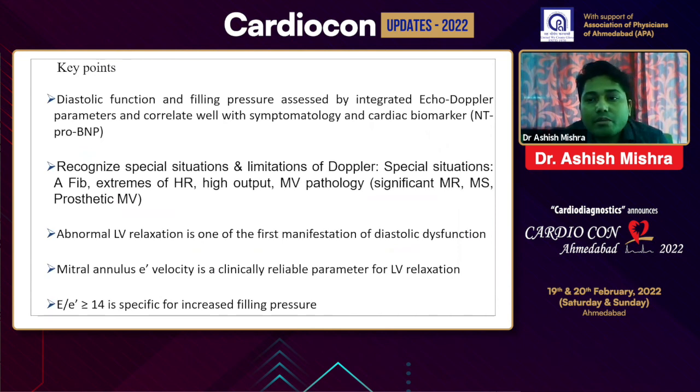Coming to the end of our talk, the key points: diastolic function and filling pressure are assessed by integrated echo Doppler parameters and correlate well with the symptomatology and the cardiac biomarkers. Recognizing the special situations and limitations of Doppler is also important, particularly situations like atrial fibrillation, extremes of heart rate, high output states, and mitral valve pathologies, when assessing the LV diastolic parameters.